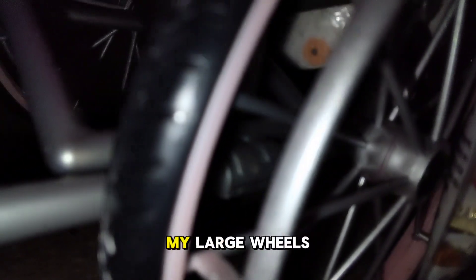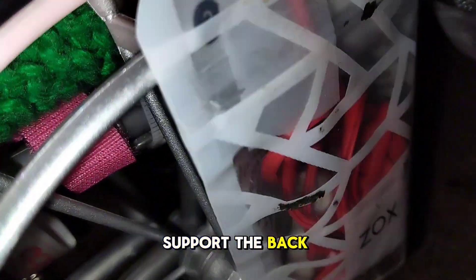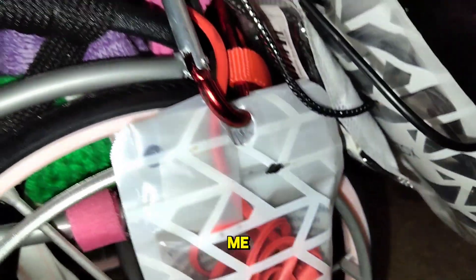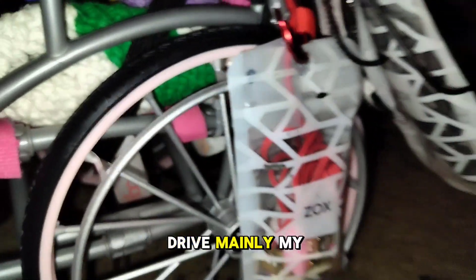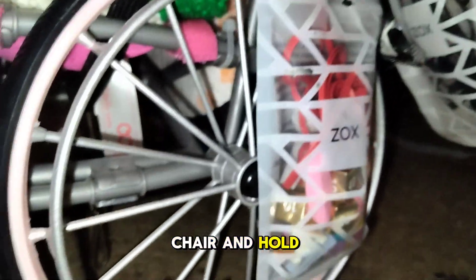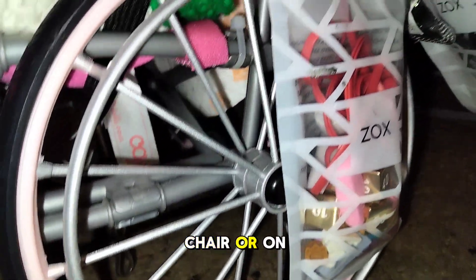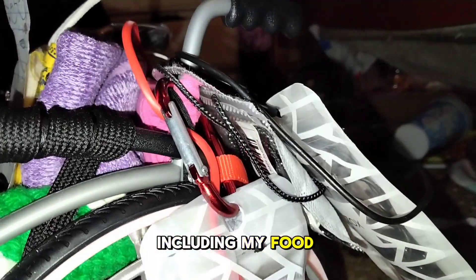First up are my large wheels that mainly help support the back of my chair, including all my bags on the chair. They help me drive my chair mainly and hold all the large heavy stuff that is in or on my chair, including my food bags and everything.